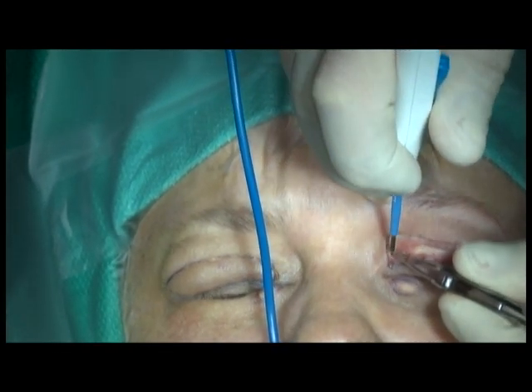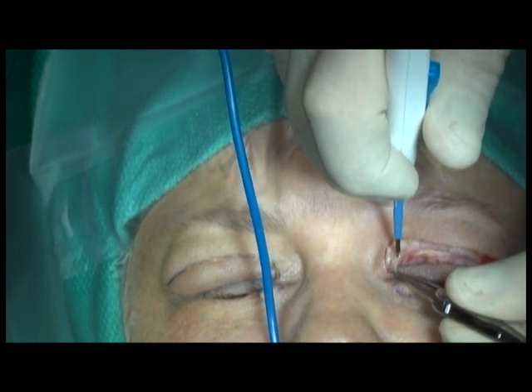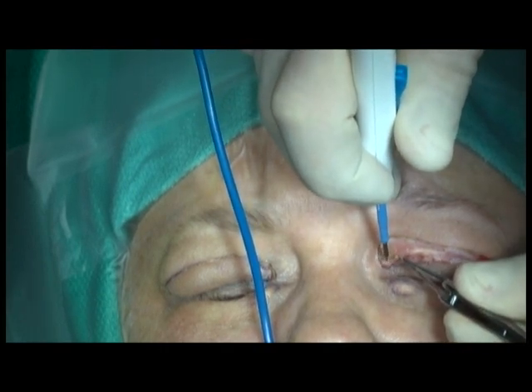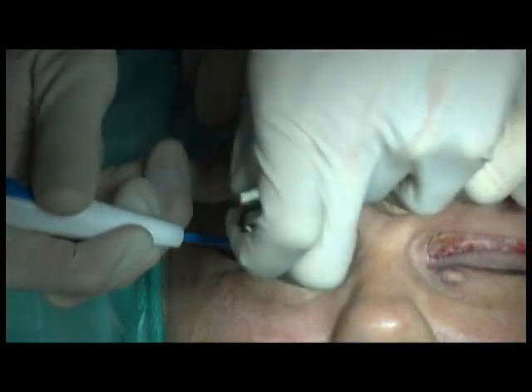Superiorly, remaining xanthelasma is excised at the edges of the incisions. This is performed in the exact same manner on both sides. Hemostasis is obtained with the unipolar cautery.